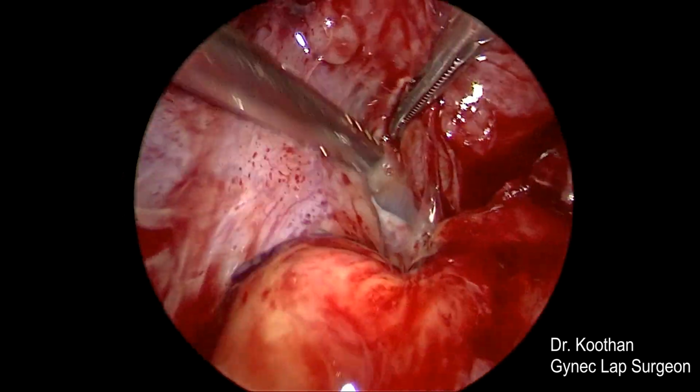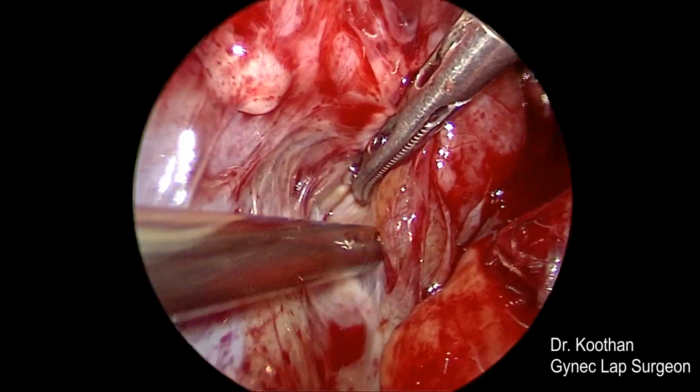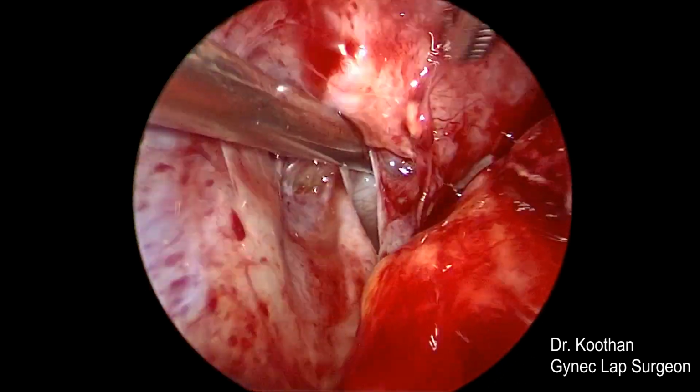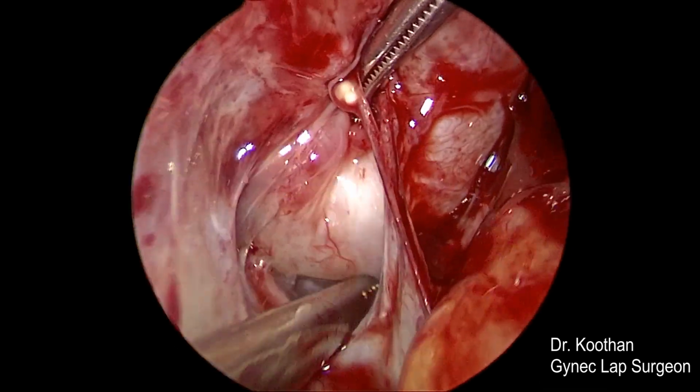This is actually the adhesion between the lateral pelvic wall and the Pyosalpinx. We are dissecting the space between the lateral pelvic wall and the Pyosalpinx, the posterior surface of the Pyosalpinx.